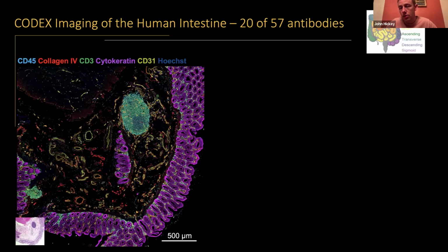That biopsy gets cut into really small, thin sections, put on a slide, and then we put on these molecular paints, which are basically DNA conjugated to antibodies. And then we read them off and visualize them with our microscope. Each individual color represents a different molecular paint that's targeting a different molecule, and we can see that our individual cells here are expressing different molecules.